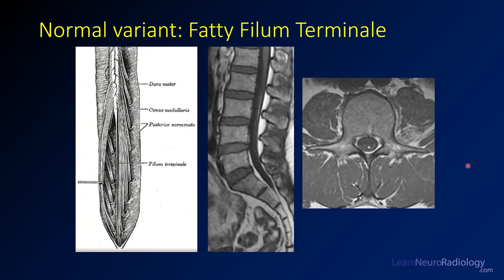A normal variant that can look similar is the fatty filum terminale. On T1 you see a thin linear T1 hyperintense structure along the filum terminale. On axial images it almost looks like a nerve root, but it's T1 bright or fatty. This is a normal variant that appears in quite a number of people and is relatively common, so don't necessarily call all of those lipomas.